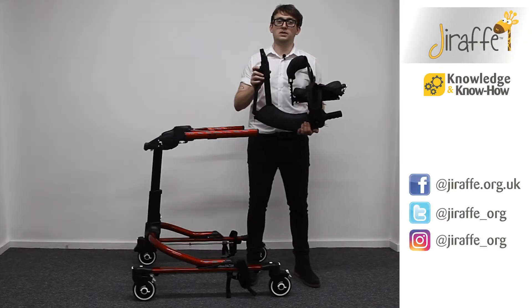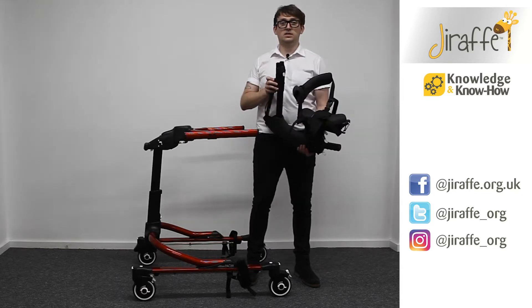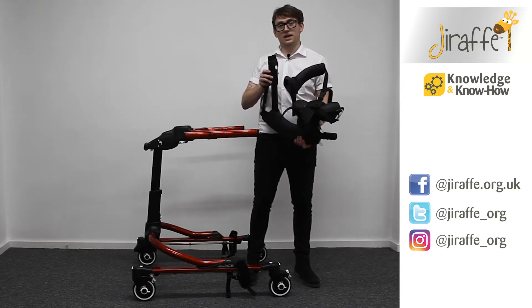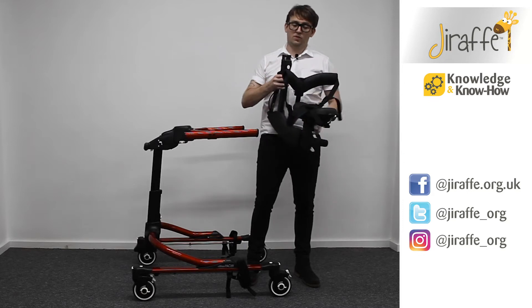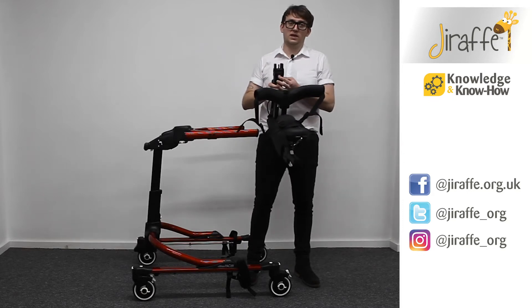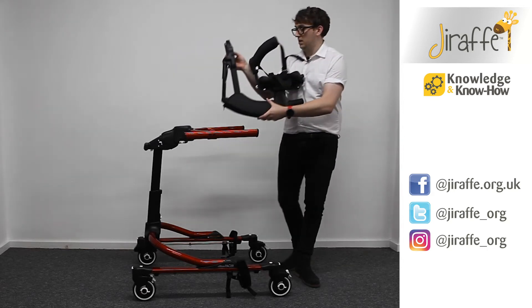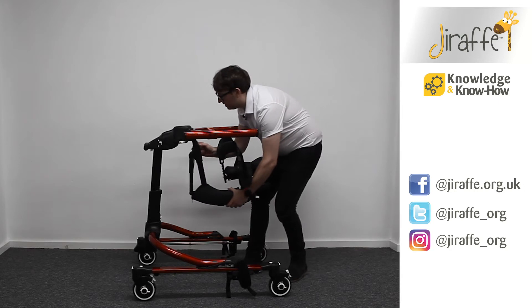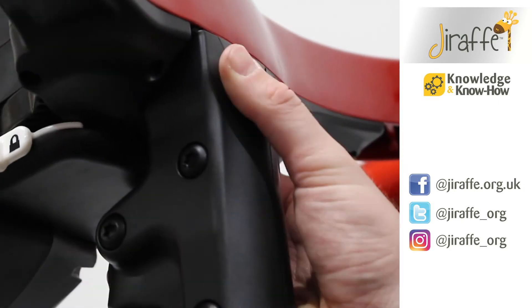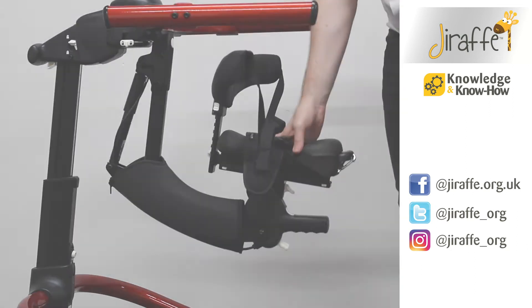Now we're going to look to fit the multi-positional saddle onto the dynamic pacer. The first thing we need to do when fitting the MPS onto the frame — we've got two white buttons either side here and here. You need to make sure that they are pressed in and then we're going to slot it into the gap underneath the frame. If you release the buttons, that's now in place.